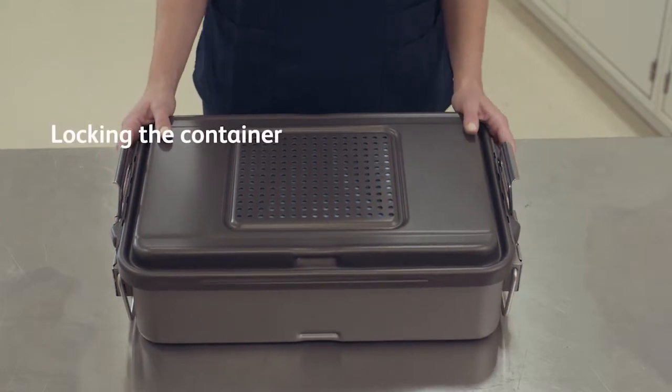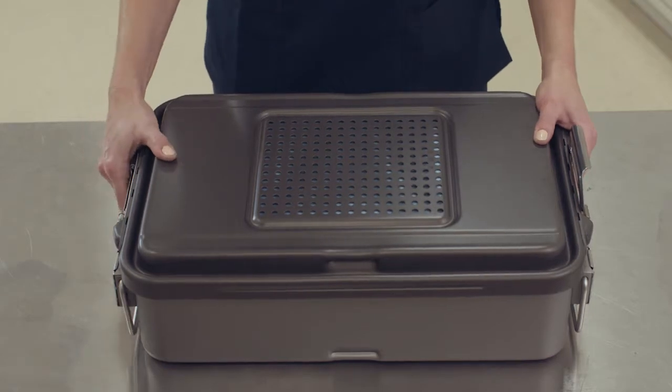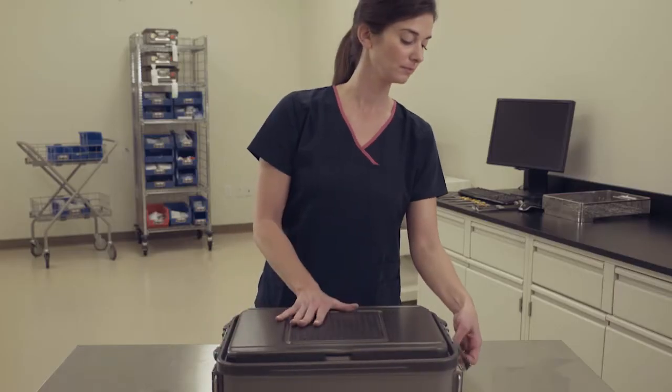To lock the container, begin by interlocking the lid latch with the bottom latch on both sides. Press down with smooth continuous pressure until an audible snap is heard, confirming the latch is secured.